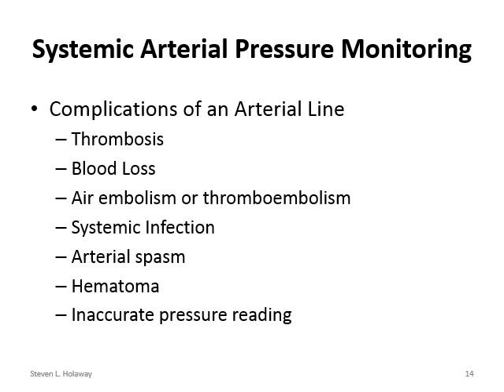Systemic infection, again, you can get that because we're going directly into the arterial site. That's always a complication. You can see arterial spasms, rare but can happen, and that's where you would see changes in your blood pressure and you would see the waveform change. You can get a hematoma from the site itself because blood's leaking around it. You're going to see that more as you take out the arterial line if you don't hold good pressure on the site. You need to hold pressure on, when you take out an arterial line, at least 5 minutes.